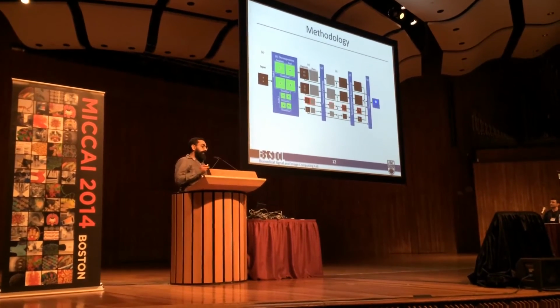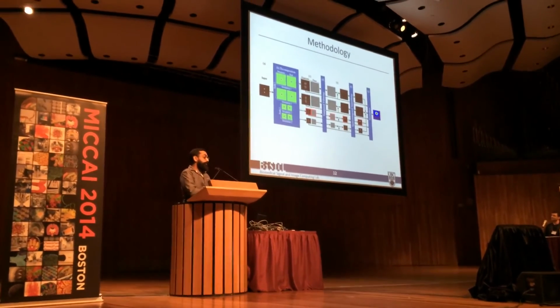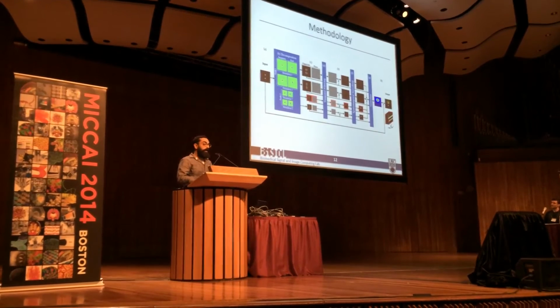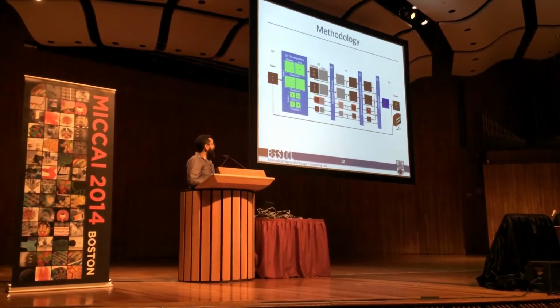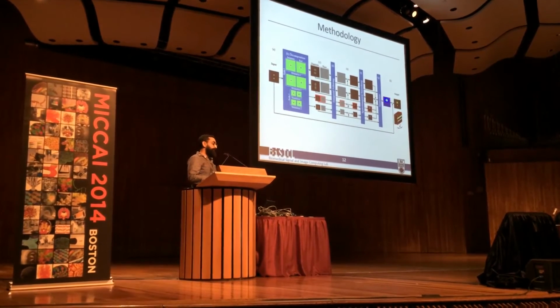The resulting labels, overlays can either be shown as they are, or they can be added back to the original video in an augmented reality manner, so the surgeon knows exactly what is pulsating.